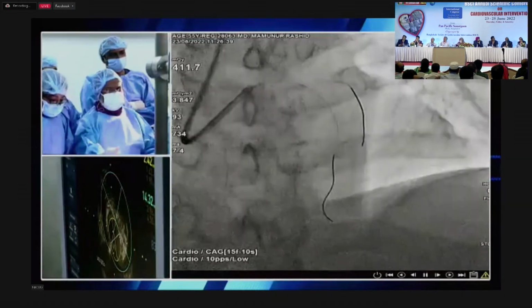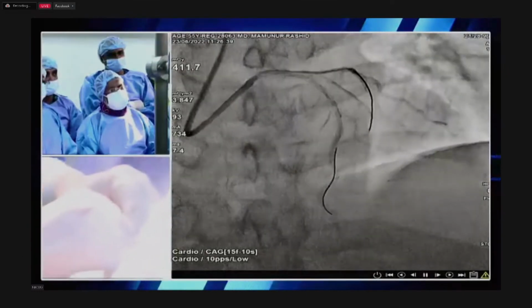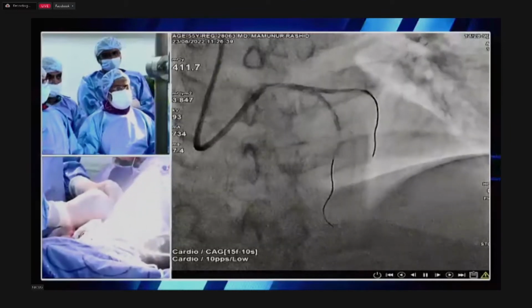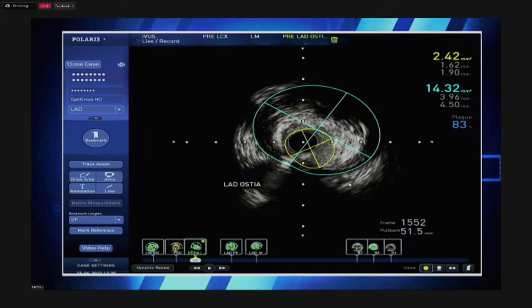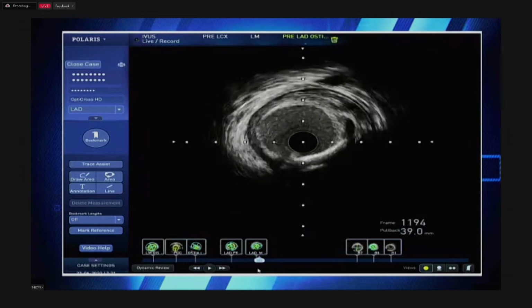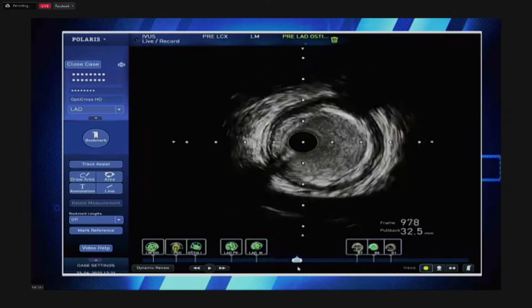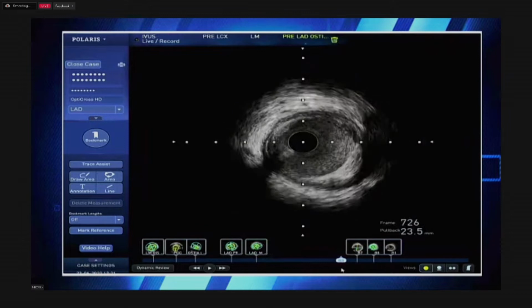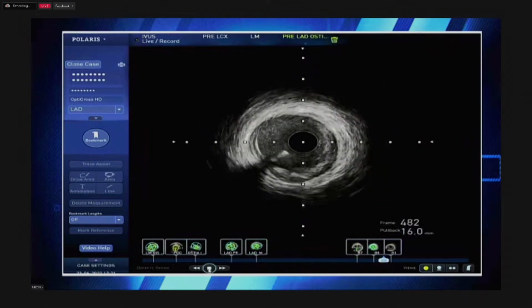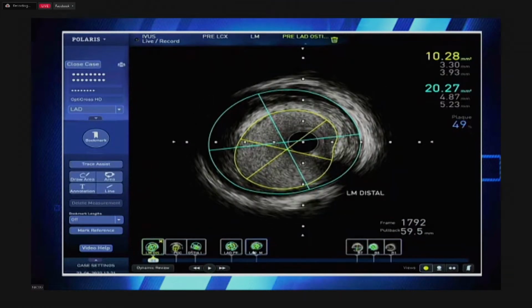Thank you, Dr. Kalra. Now we want to put a stent from mid left main to proximal to the diagonal, because I do not want to disturb the entire left main or ostium of the left main. If this patient will require a further procedure, then it will be difficult for a subsequent procedure when the ostium of the LM is stented previously. If it is necessary, then we will have to do it, but my IVUS shows only minor plaque in the distal part of the LM. Even then, I want to cover 8 millimeters from the bifurcation into the left main for POT. And this is my decision.